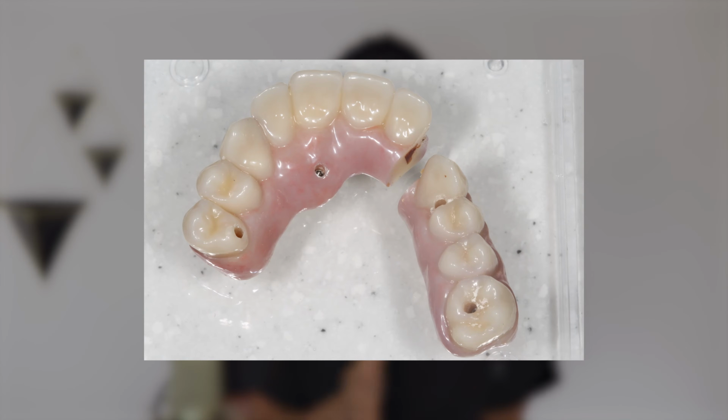There is an upgrade. We can have zirconia teeth, which are very unlikely to break. I have broken a zirconia bridge, so it's not indestructible, but it's much, much stronger than the acrylic ones, and there's less issues in terms of teeth breaking after they're fitted.